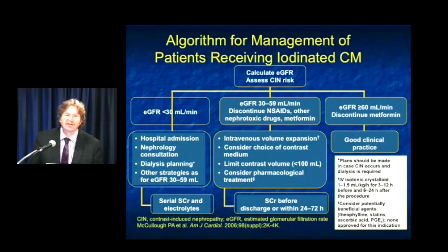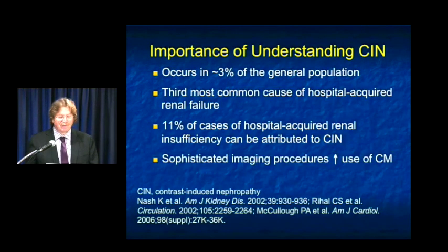There are lots of charts. We still use creatinine levels. Many people use GFR. Either one works. The GFR became very popular with MR. The key thing is trying to figure out the risks of individual patients. And although there are many charts like this one, the risk-reward is often not readable from these charts, and I'll cover some of that information.